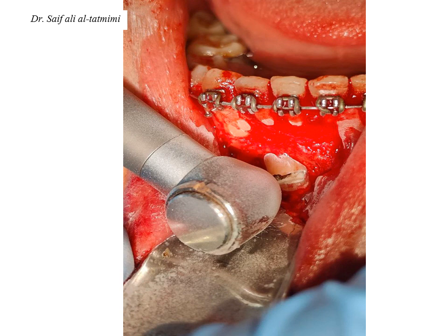After luxation of the tooth, I usually cut the crown and separate it from the root. This is using a turbine and a fissure bur. Cutting the crown from the root will minimize the amount of bone removal needed for the extraction and also will protect the adjacent teeth from unnecessary trauma.